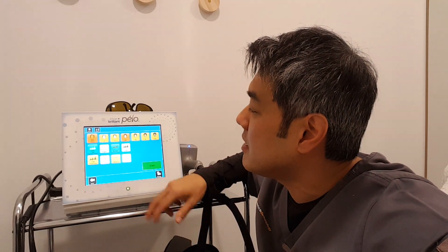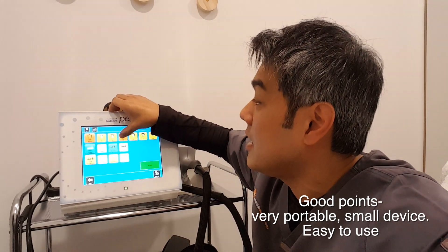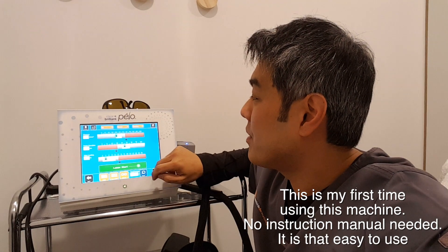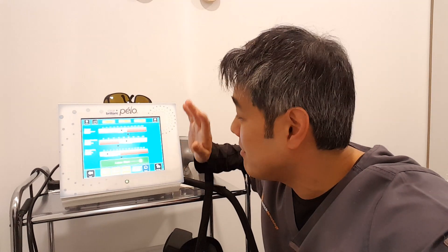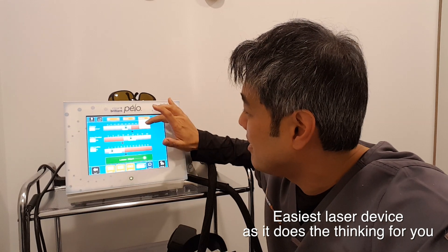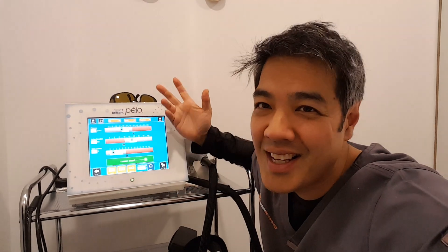It's very intuitive. I look at the skin type — I'll probably be a skin type 3, so we hit skin type 3, select, accept. We can adjust the fluence and the pulse duration. It's a very intuitive device. I don't do laser hair removal myself, but just looking at it, it looks pretty easy. Medium hair, brown hair — or in my case, dark hair. Let's see how it fires and let's see how much it hurts.